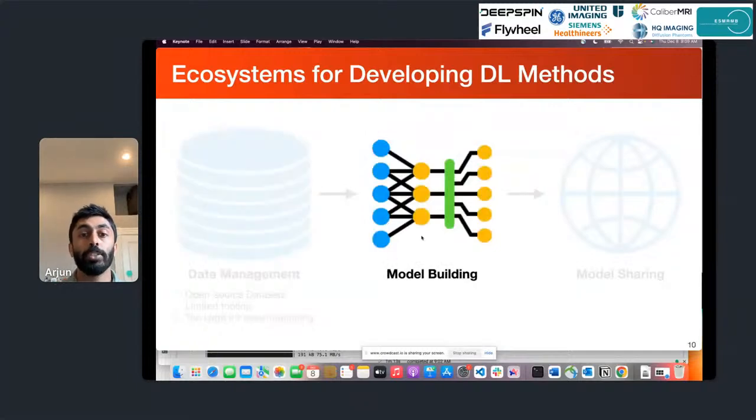Additionally, when we're thinking about model building, we've, again, pushed a lot towards open source code, and this has been quite exciting, but it's often led to a lot of fragmented code. So there may be a lot of different code bases that build different things in different ways. And Jeff and Tobias mentioned that having so many different pieces can often also make reproducibility and standardization challenging, because there ends up being a lot of duplication or boilerplate code that you need to write. So this push towards open source software is really how do we build good sets of tools that can really be repurposed by other folks in our community.